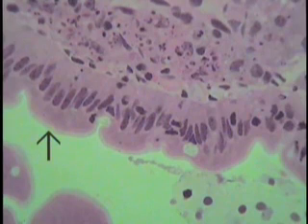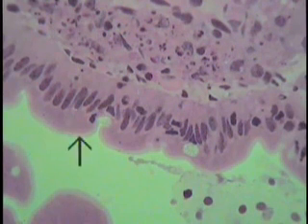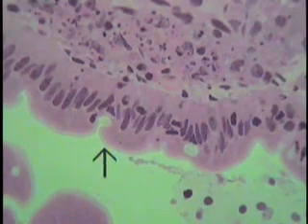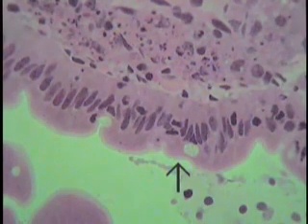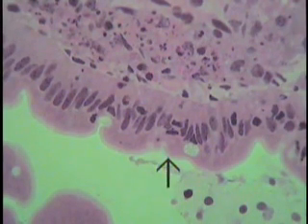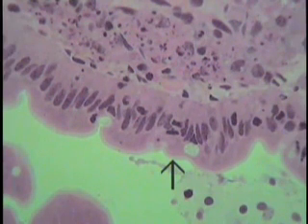Because the small intestine is involved in tremendous absorptive capacity, it shows this fringe of little finger-like extensions of the cell membrane extending from the apical surface of these cells. This is the so-called microvillus border, or if you're using older text, the light microscopic term is often used. That is a striated border because it has little stripes, or so it appears. There's little indentations or stripes extending from the apices of these cells. Nonetheless, this striated border is representative of an intense microvillus border.